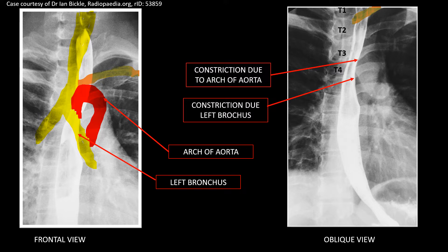As seen in the frontal view, this is the trachea, which at the T4 level bifurcates into the left bronchus and right bronchus. This is the arch of the aorta, and this is the clavicle. In the oblique view, we can identify a constriction due to the arch of the aorta and a constriction due to the left bronchus. The fourth constriction is at the point where the esophagus pierces the diaphragm, and the first constriction is at the initiation of the esophagus. These four are normal anatomical constrictions of the esophagus.